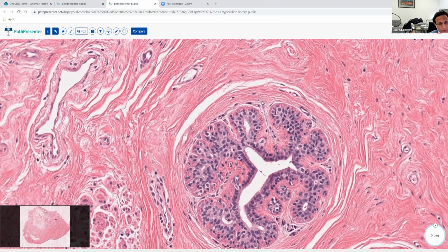And those might stain with E-cadherin. And that will create some confusion whether this is LCIS or not, because you will kind of think, oh, could this be mixed LCIS, DCIS because of E-cadherin? No, it's not like that. You have to morphologically recognize that those were the benign cells.